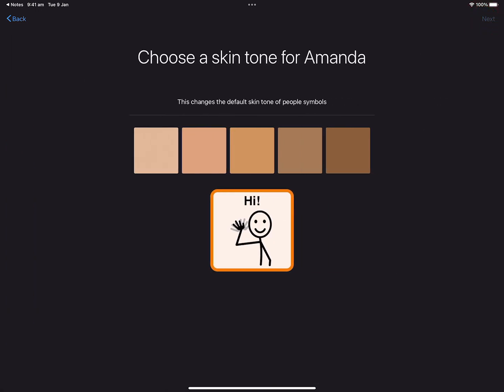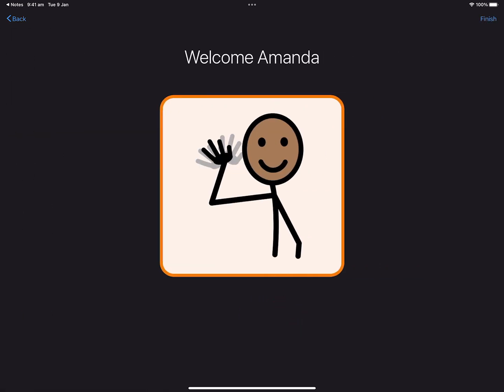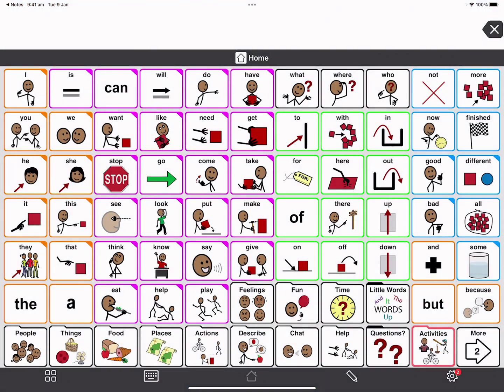Now I choose a skin tone. This will set the default skin colour of the people symbols used in Proloquo2Go. Then tap Next. To help improve products, you can see that anonymous information is collected, so this gives me an opportunity to give my consent. I will agree and continue. My user for Amanda has been made — I tap Finish.